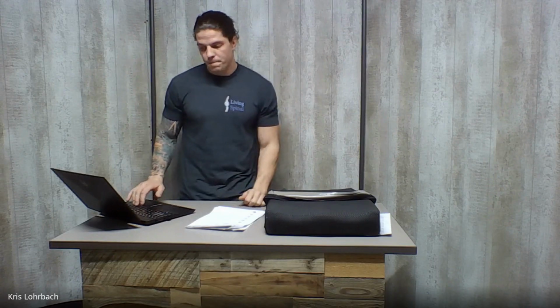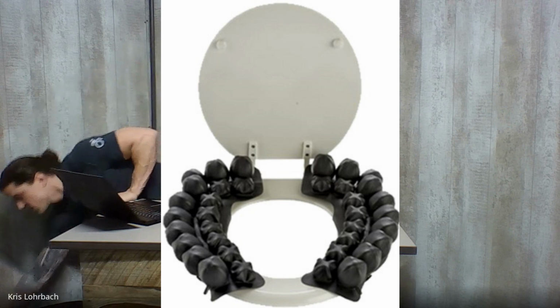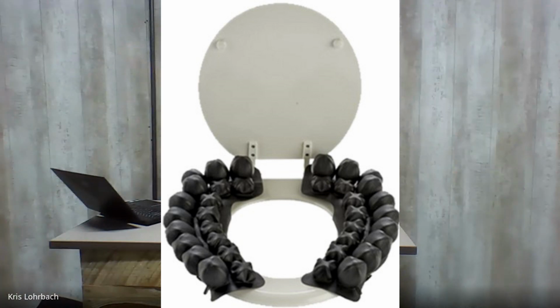A lot of different cushion companies make cushions for all different kinds of chairs. One great example of that is commode cushions. So you'll see Roho will make these Roho cell pads, but they'll make them in the shape of a toilet seat so that you can put it on top of a commode. And it usually has some kind of strap that goes around the seat so it doesn't fall off when you transfer onto it. So, one final note about that.